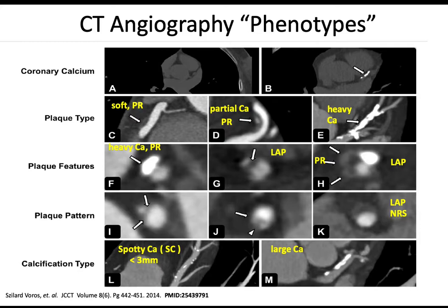You can also see here, for example, the idea of having a thin fibrous cap. If a plaque has a kind of thin boundary holding it, the idea is that it's a vulnerable plaque that might rupture, whereas calcified plaques may be more stable. You can think of it as a ticking time bomb, and the question is, what is the likelihood of it exploding? If it's entirely stable and dormant, then it might impinge blood flow when you're running a marathon, but it won't necessarily give you a massive heart attack, which is more of a rupturing, acute phenomenon. And so you might want to treat those differently.